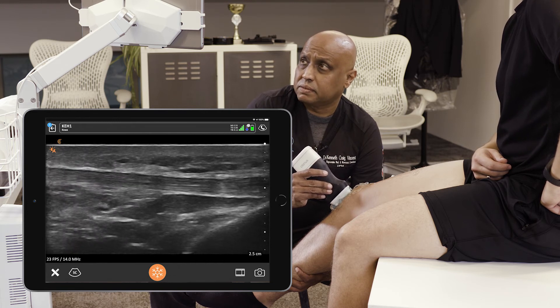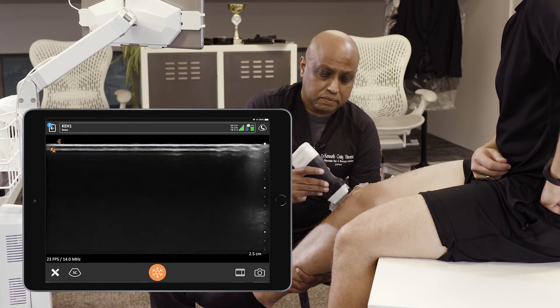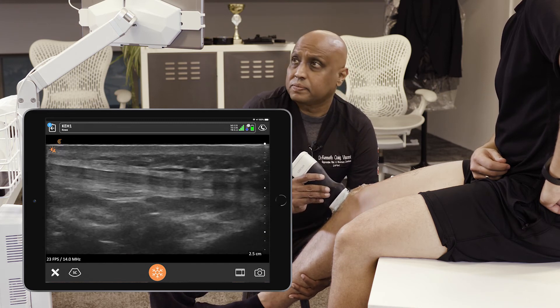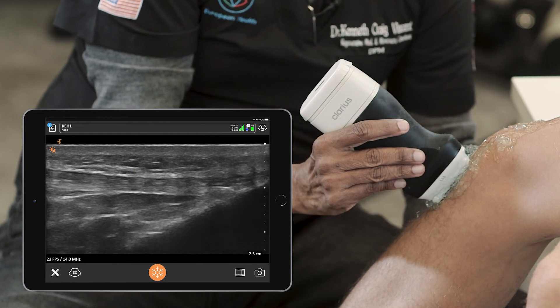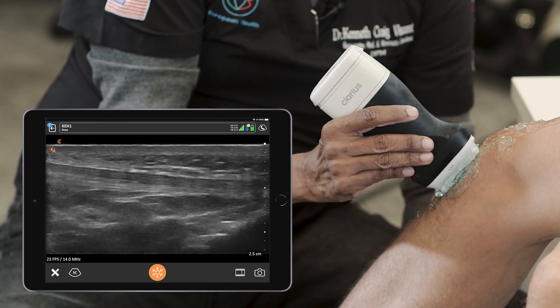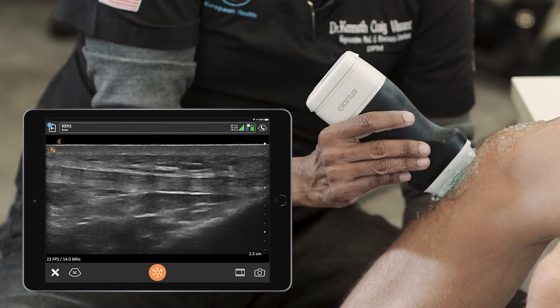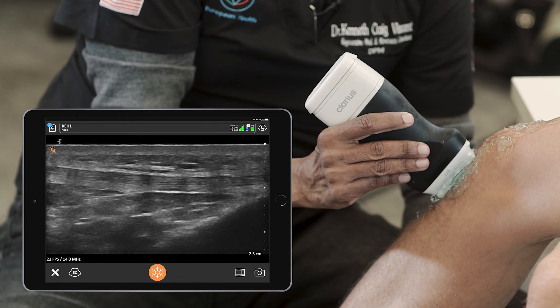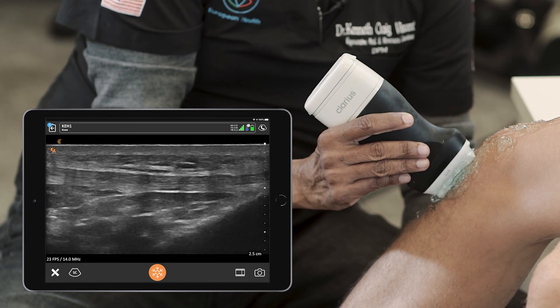We move further down distally towards the tibia, and we now appreciate the region of the insertion. There are some signs of old injury, but as I mentioned, just because there are variations from what is classified as normative values, we have to consider that these could be adaptive changes and not an active, functional, inhibiting or limiting pathology.